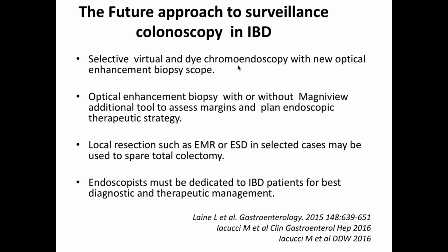I'm sure everyone can do great chromoendoscopy after training, but if you detect a lesion, maybe it would be great if you can send the patient for reassessment to the tertiary referral center with more experience in optical biopsies, characterization of lesions, and advanced therapeutic endoscopy.